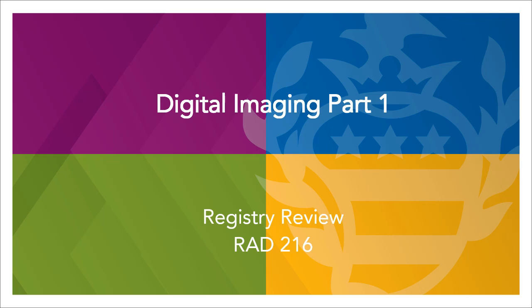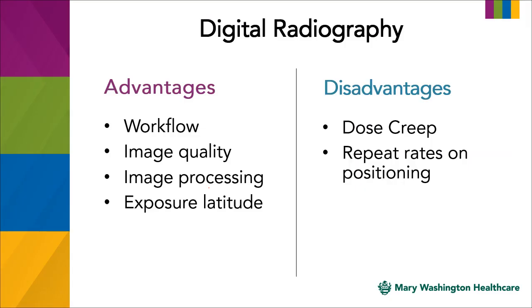Digital Imaging Part 1. The advantages of digital radiography include the workflow. Compared to film screen radiography, there's a huge change in the workflow. We have fewer people that have to be employed in radiology now, and the workflow is much faster and much more efficient. Image quality: we have quality images, even though we make mistakes. The computer is going to adjust for the brightness and the contrast, so we really have good quality images.